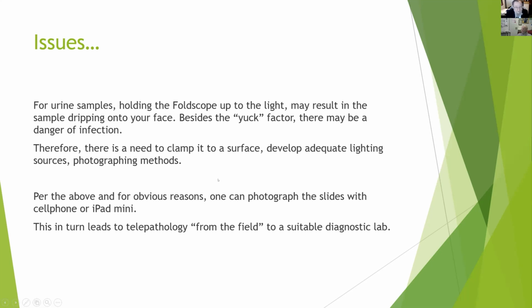You can do it with a cell phone, you can do it with an iPad mini, which in turn leads to telepathology from the field to a suitable diagnostic lab, depending on your circumstances.